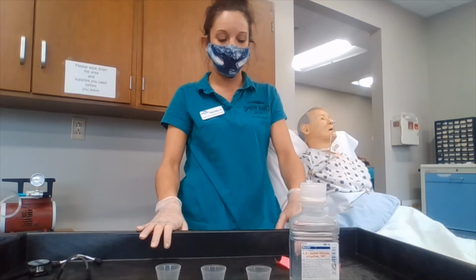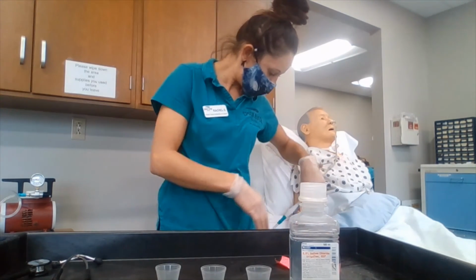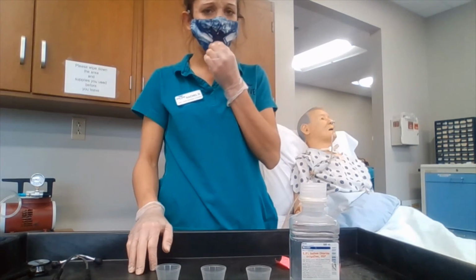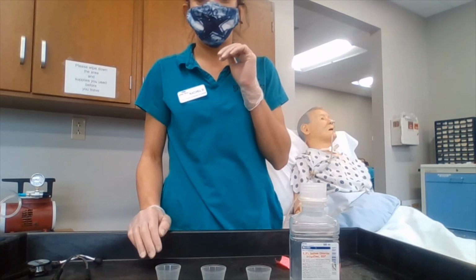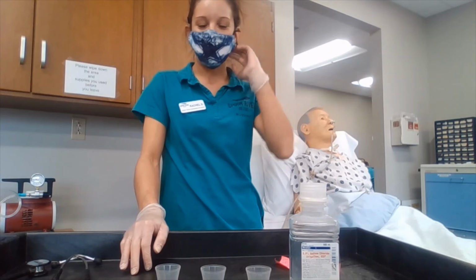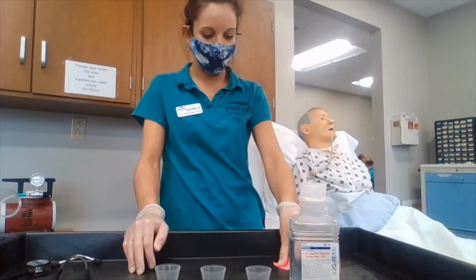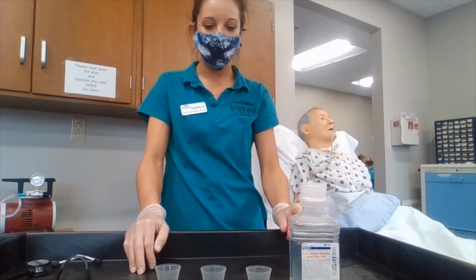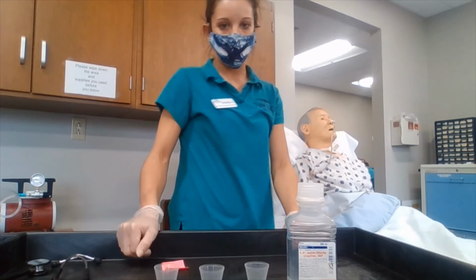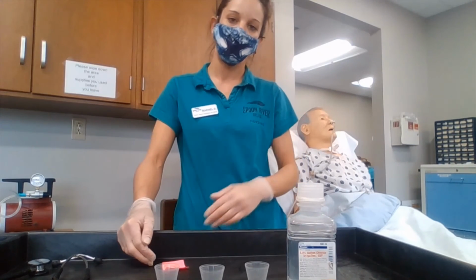For administering medication through the nasogastric tubing, we are first going to be following generic medication administration guidelines. If we are going to be distributing a multi-dose, then we are going to make sure that we have the correct amount. We're going to be ensuring that we are able to crush or mix the medication.